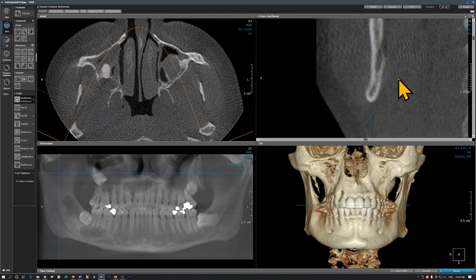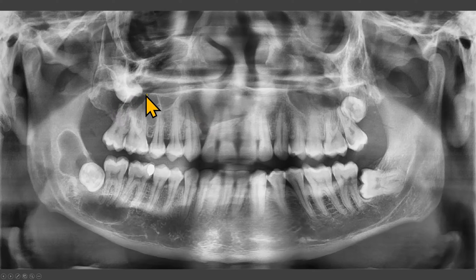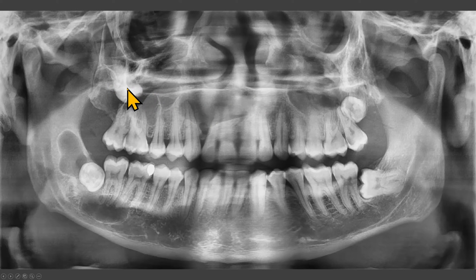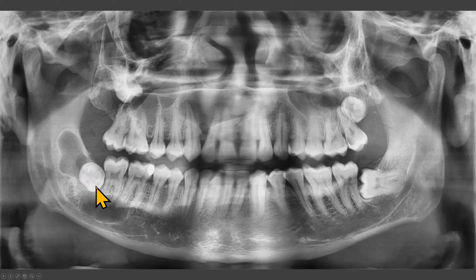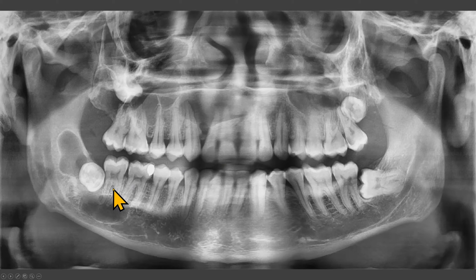Let's go back to our panoramic radiograph. We had seen this lesion and this lesion on the panoramic radiograph. We appreciated the expansion of the cortical plates — or lack thereof — on the CBCT scan. This large odontogenic keratocyst associated with the maxillary left third molar is still not visible on this panoramic radiograph. We also saw this elongated tunnel-shaped radiolucency with some scalloping. So multiple odontogenic keratocysts: one, two, three, four — and there may be some smaller ones in these areas.